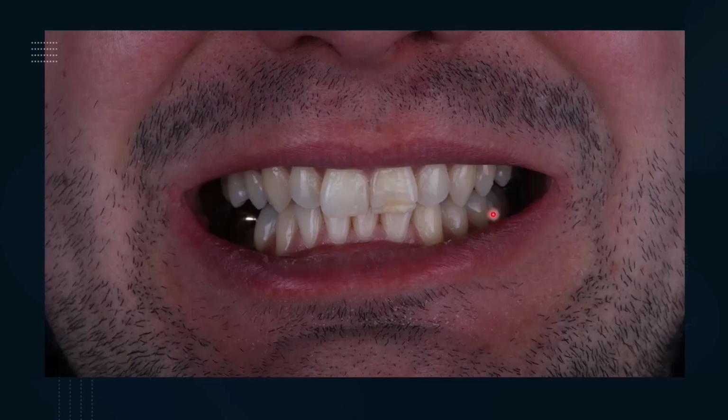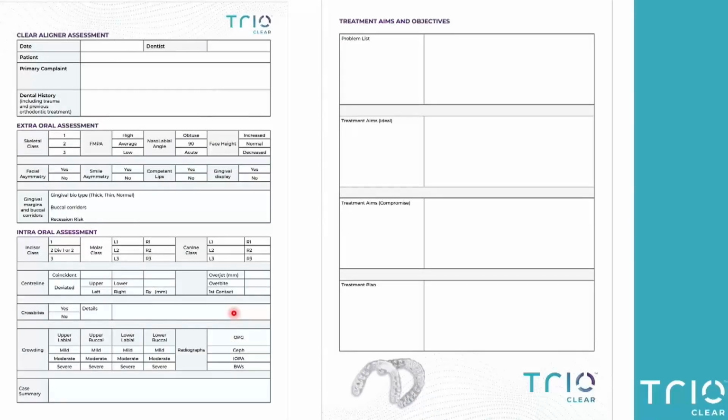This area here, for those who might be new to this, is known as your buccal corridors, okay? And so there is a section on this in the assessment form, and we'll talk to you about the kind of wording that you can put into that in a second.